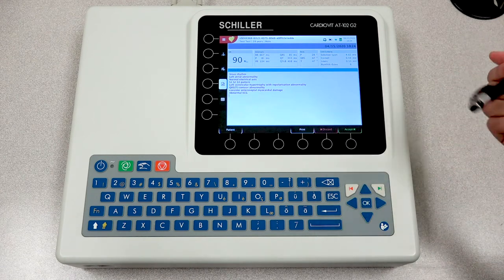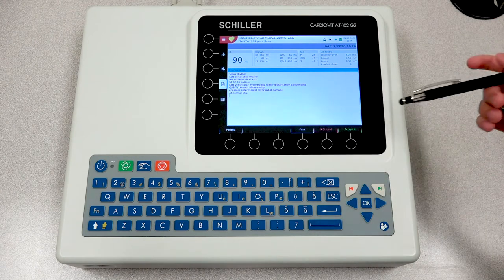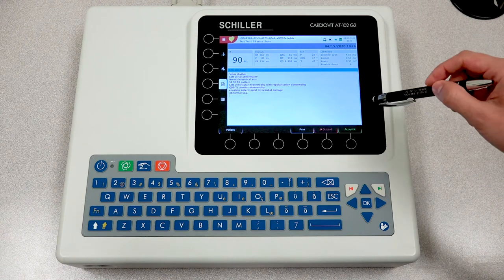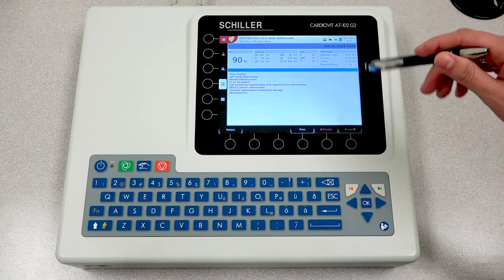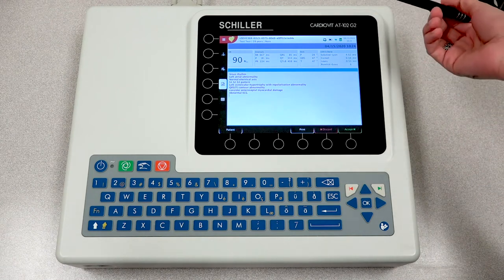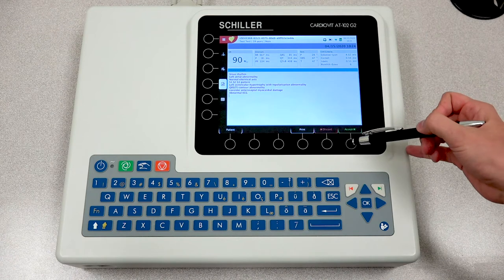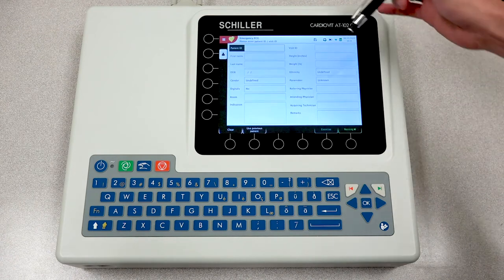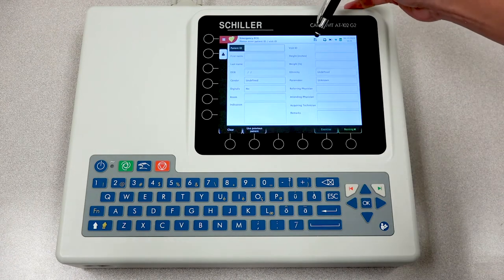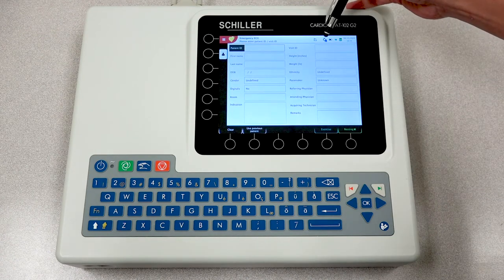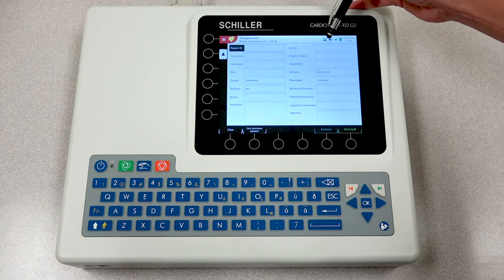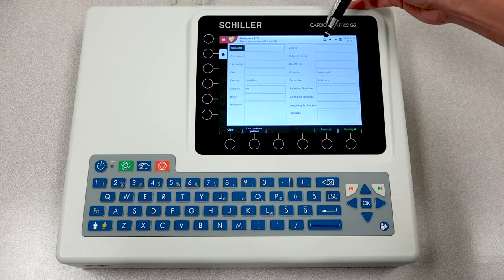In this case we agree with the test, so we're going to go ahead and press accept. This unit is configured to automatically transmit to the server, so once we press accept it will indicate that it's saving into internal memory, and this will indicate that it's being transmitted. That green check mark confirms that it was completed.